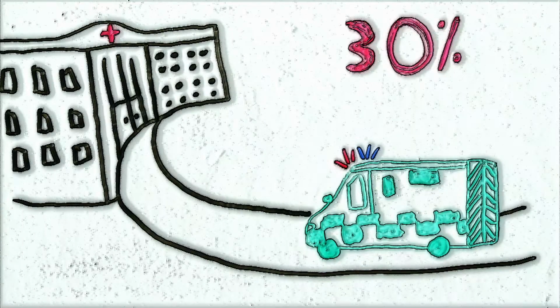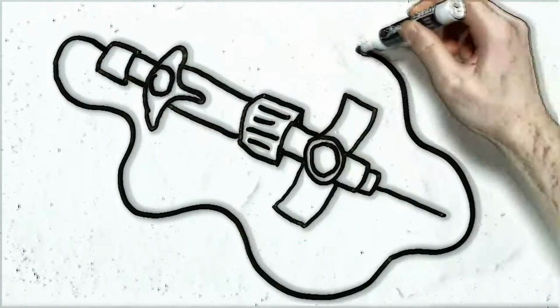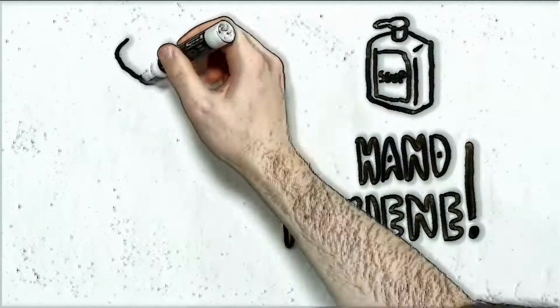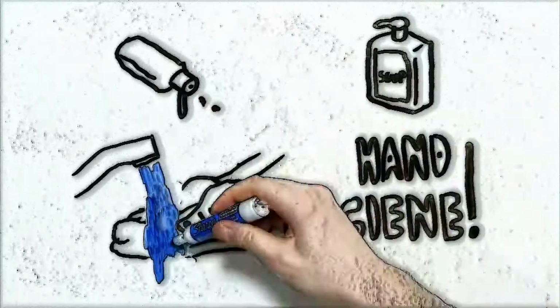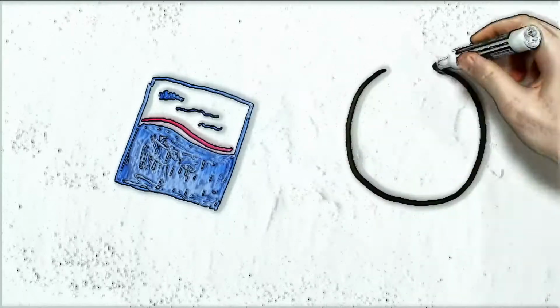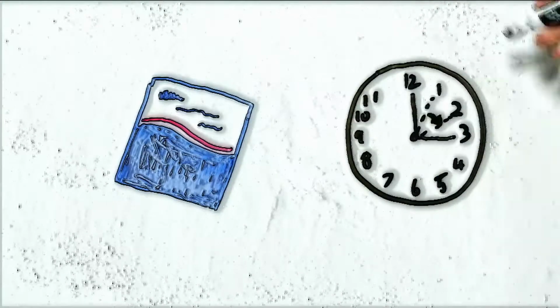30% of patients that come into hospital will have a PVC inserted for the administration of intravenous therapies. It is important that aseptic technique is carried out to ensure the risk of infection is minimised. Prior to insertion, hands should be decontaminated and the patient's skin cleansed with chlorhexidine and isopropyl alcohol wipe for a minimum of 15 seconds to remove any skin contaminants and allowed to dry.